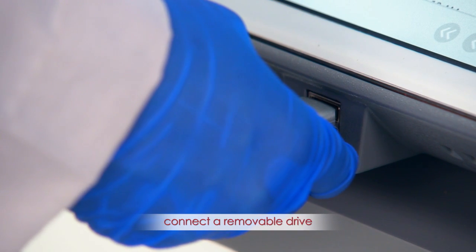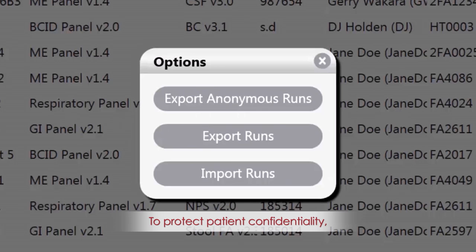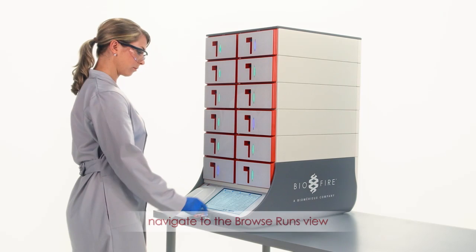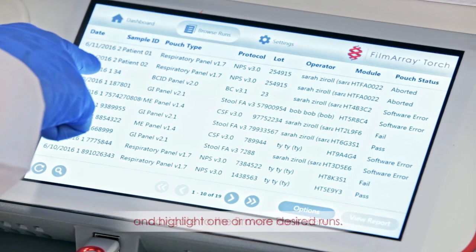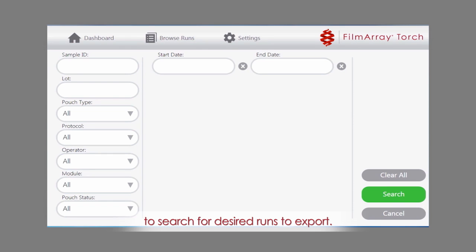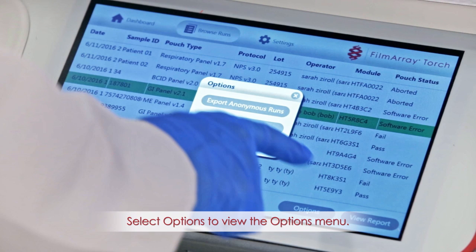Export runs. To export runs, connect a removable drive that has storage capacity. To protect patient confidentiality, use Export Anonymous Runs. Export Anonymous Runs replaces the sample ID in the run file with the text Anonymous. To export anonymous runs to a file, navigate to the Browse Runs view and highlight one or more desired runs. Use the Search option to search for desired runs to export. Select Options to view the Options menu.